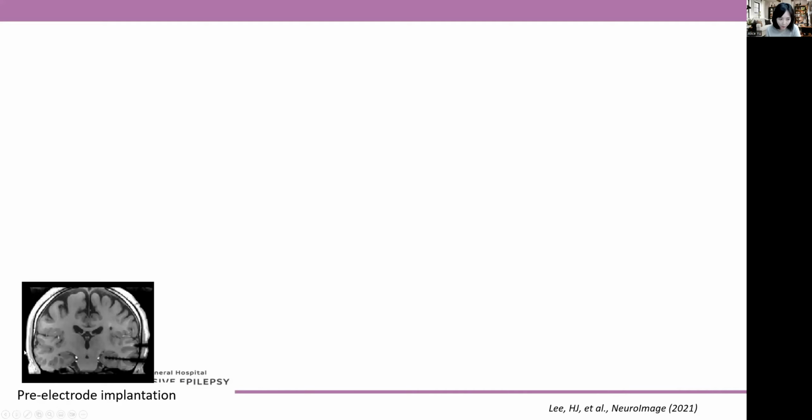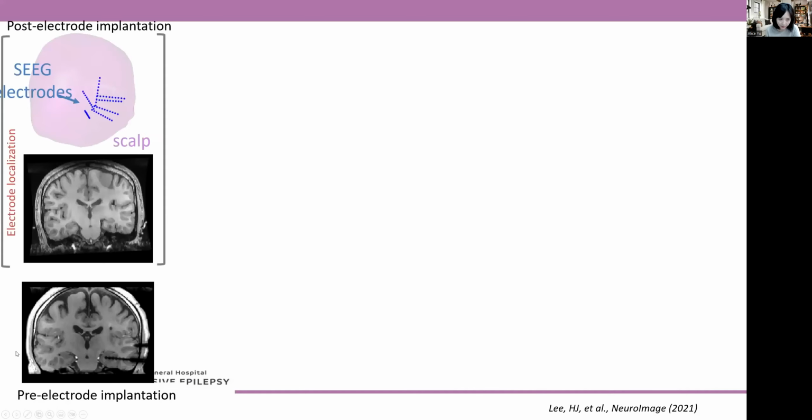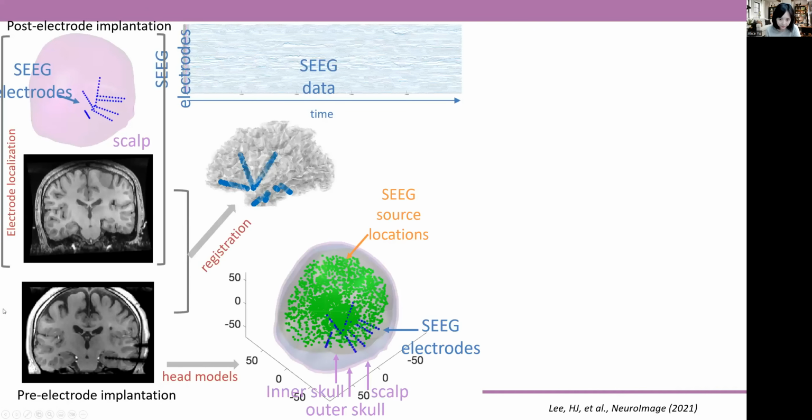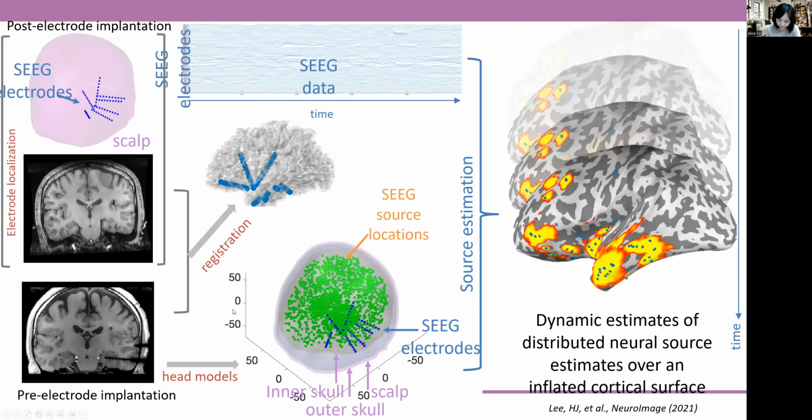This is how we process the intracranial source modeling, and we estimate the whole brain activity from the implanted SEEG. The method was published last year.